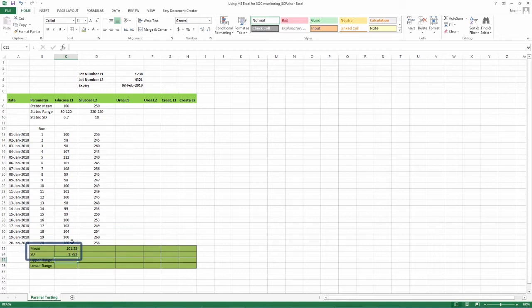You can reduce the number of decimal places like this. Select the two calculated numbers. Go to decrease decimals on the toolbar. In the case of glucose, as we do not report patient samples in decimals, we can take out the decimals fully.